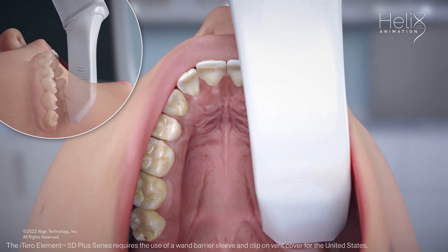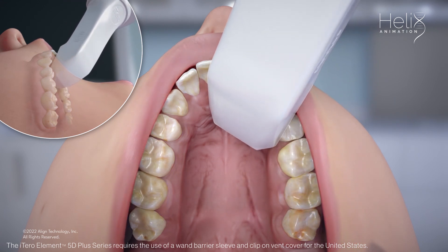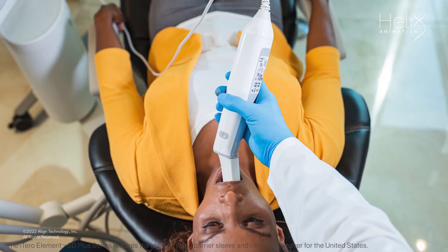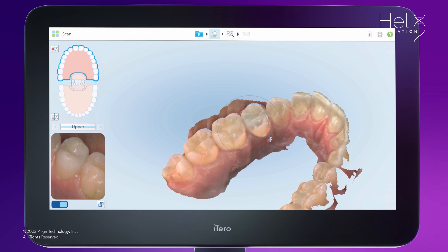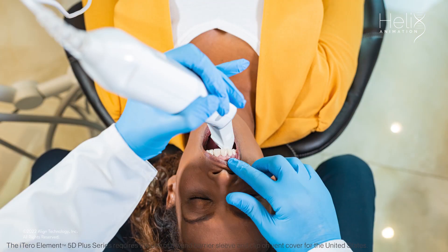Continue scanning by rolling to the palatal and capturing the palatal anatomy of the entire arch. Bring the cable end of the wand out to the side and maintain the wand tip at a vertical 45-degree angle to the lingual surface. You can visually identify that you are at a 45-degree angle if you can see some of the occlusion and the palatal surface in the viewfinder. To capture the mesial and distal interproximal anatomy, twist the wand right and left as you move around the arch.